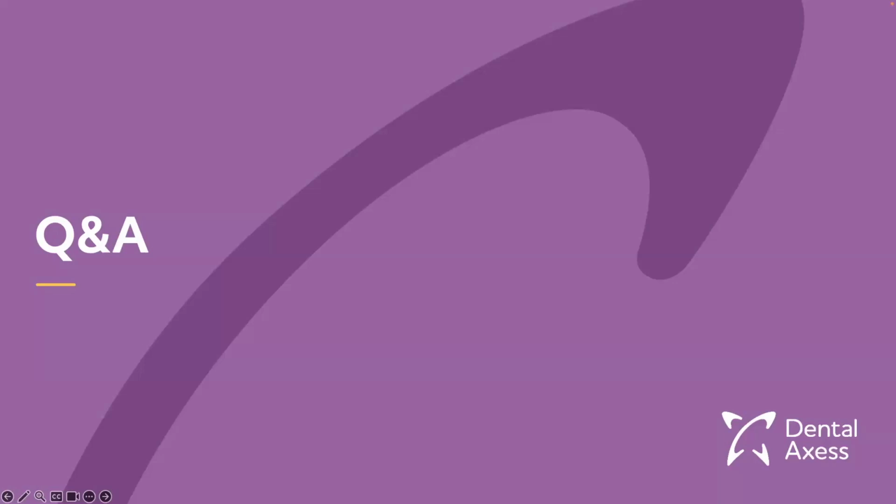question on your service. So can your service accommodate special treatment planning requests and complex cases? And it seems like you can. Yes, it is. I think the main situation is that the software allows us. Vision has a lot of tools that give me the chance to treat complex cases. As I mentioned, I have been working with several softwares, and we can have amazing final results.